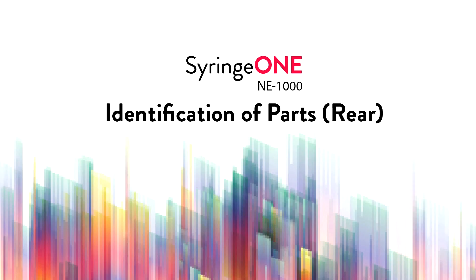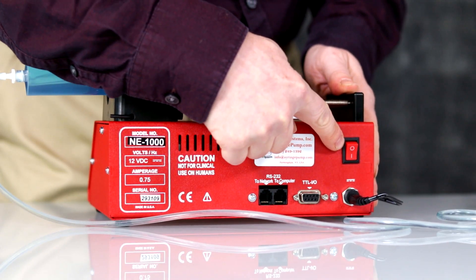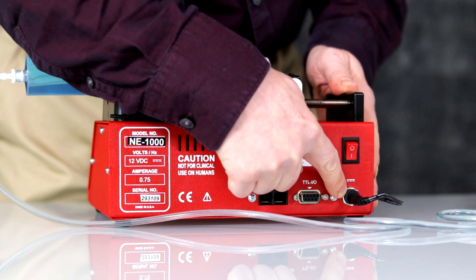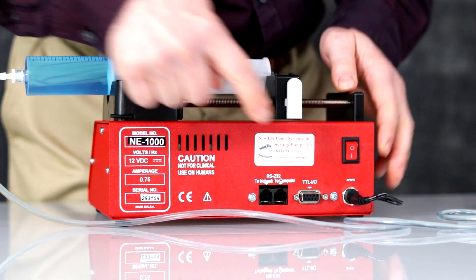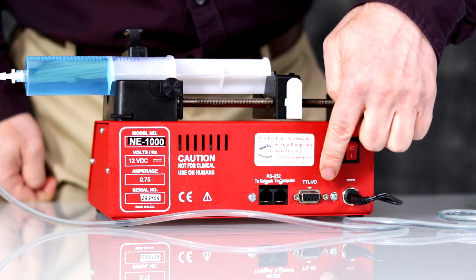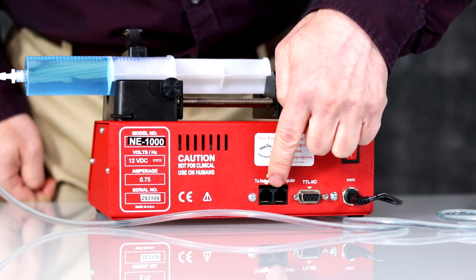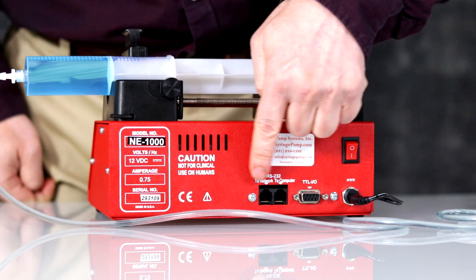Identification of Parts, Back: Power On-Off Switch, Power Supply Connections, Remote Connections, TTL Logic Interface, RS-232 Computer Connections.